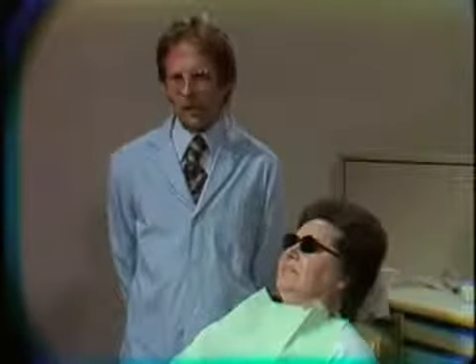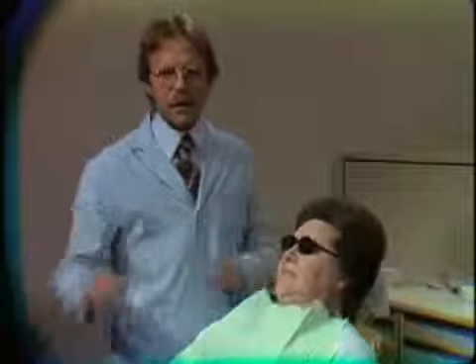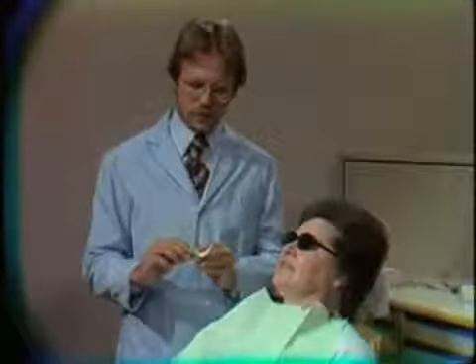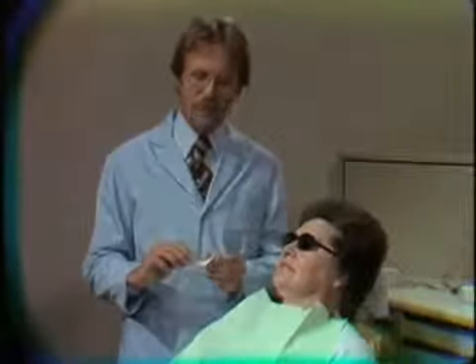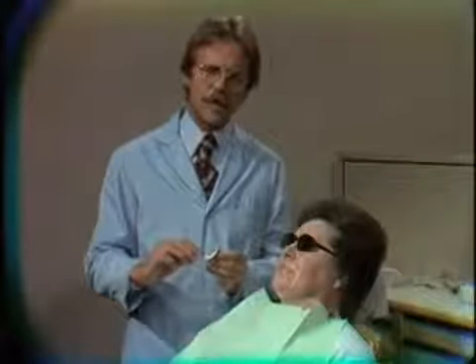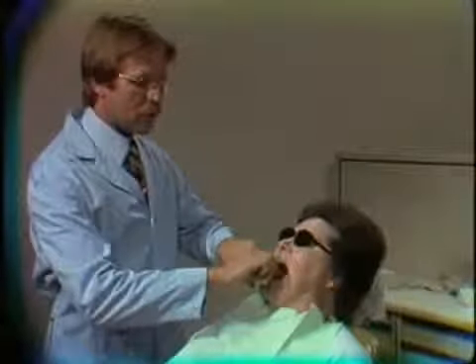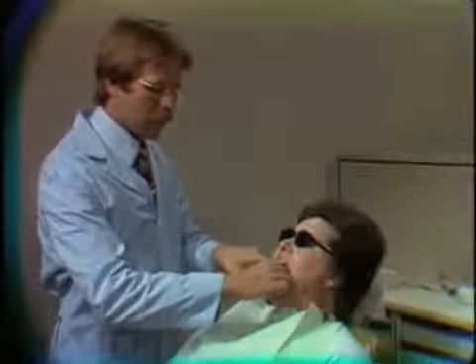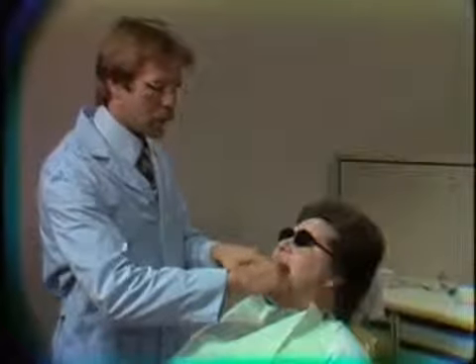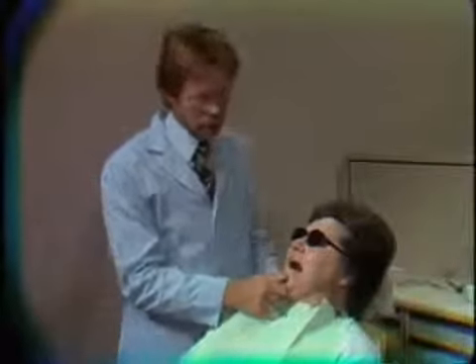The first thing we would like to do would be to take the partial denture framework with a record base fabricated from the altered master cast and try it in the patient's mouth, and be sure that this framework with the base does not impede the occlusion in any way.